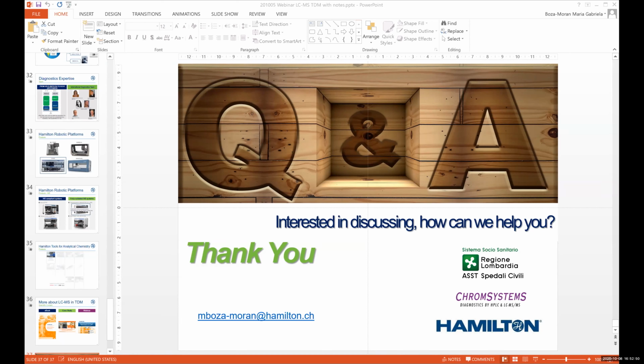Thank you. Another question is, to which MS supplier can you link your platform? I'm afraid that this is again for you, Federico. Yeah, to any supplier. So there are no limitations. So we are talking about all the principal suppliers of mass spectrometers.